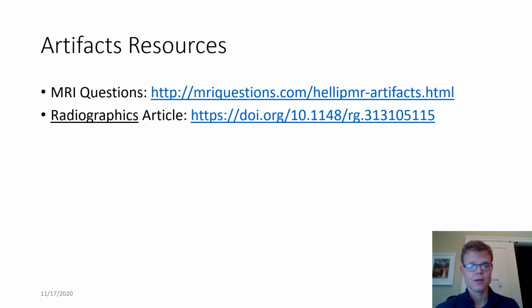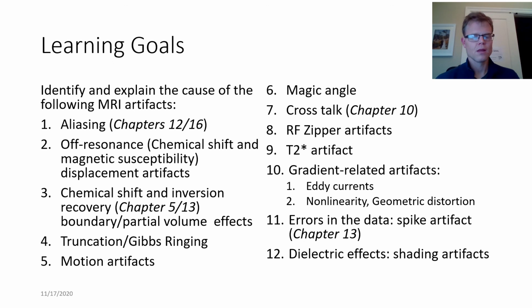Here's a couple of resources. The top, hopefully one of my and one of your favorite websites, MRIquestions.com, has a huge section devoted to artifacts, very thorough, a very good resource. The bottom link there is from a journal called Radiographics, which is an educational journal for radiologists. Both talk a lot about clinical questions, but also technical considerations as well.